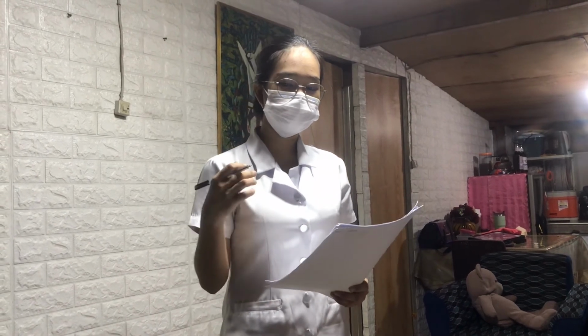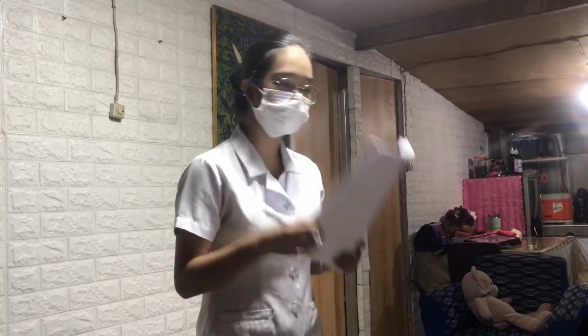We need to record all the things that we did to the patient. The rationale for this is to provide accurate data in the care of the patient.